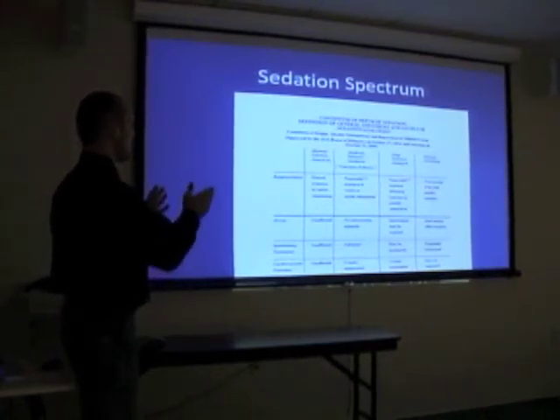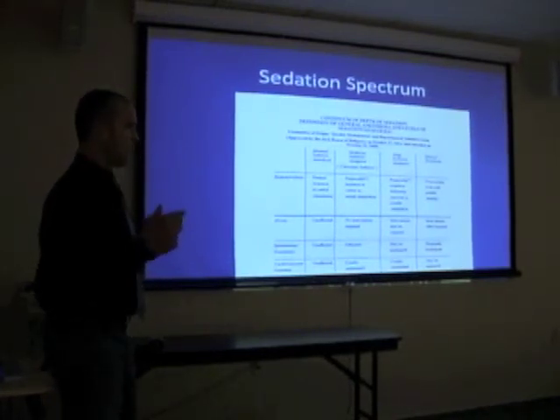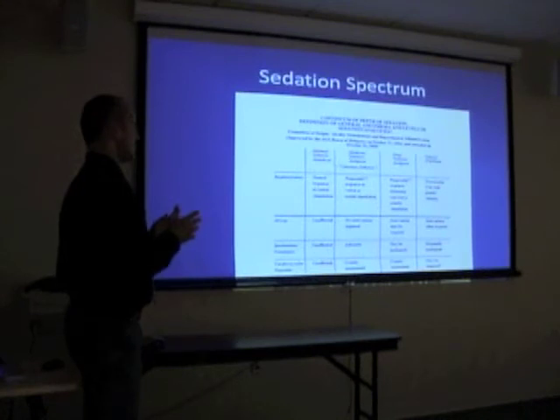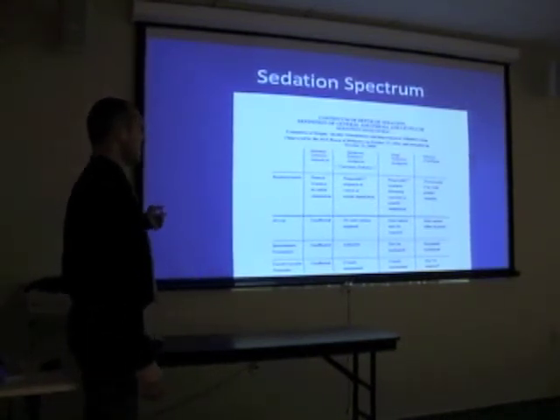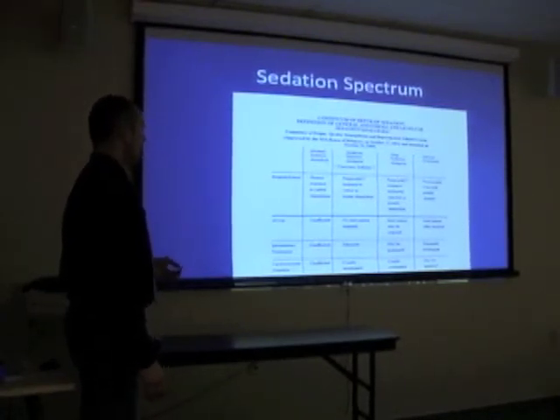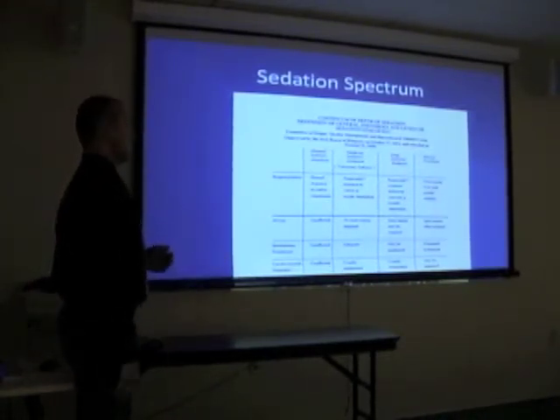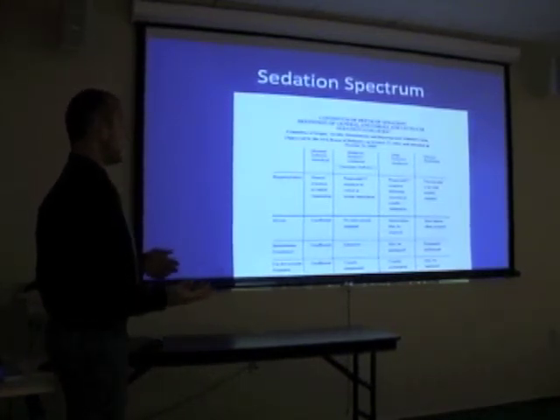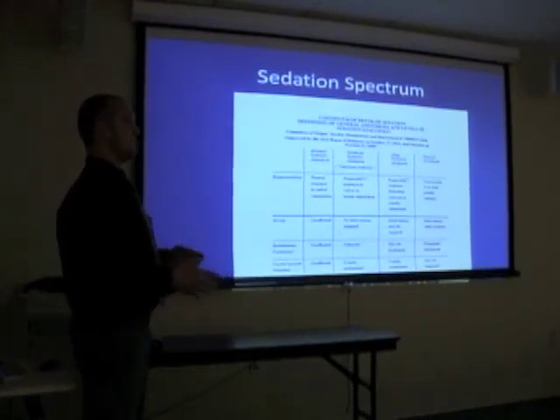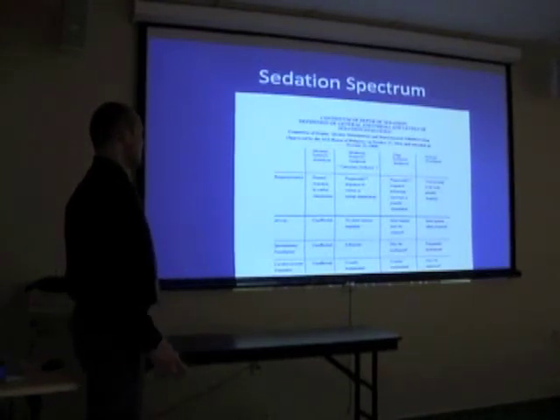But the problem that the ASA had is that going from a moderate sedation to a deep sedation case is very blurred, and it's a spectrum, obviously. Whenever you're getting into deep sedation, they say spontaneous ventilation may be inadequate, and intervention for the airway may be required. We've all had cases where you get to that point where it starts to go into the deep sedation realm. So that's really what they're trying to avoid by monitoring end-tidal CO2, is that you can avoid that, or at least recognize it when it happens. And I think that's really why they went down this road now.